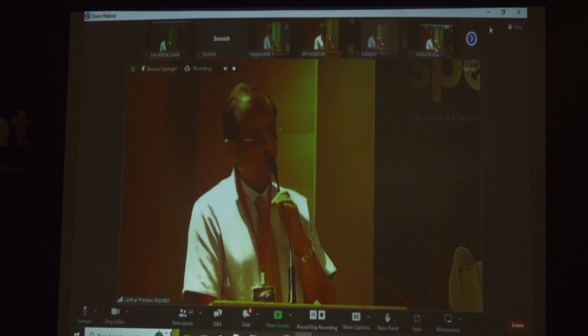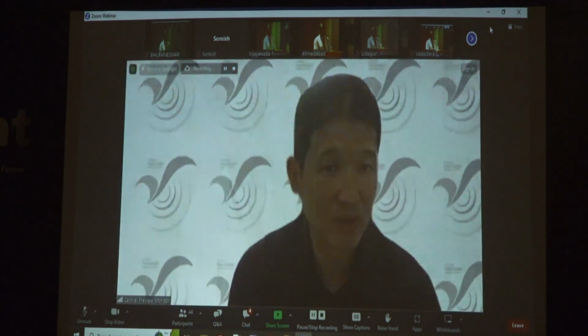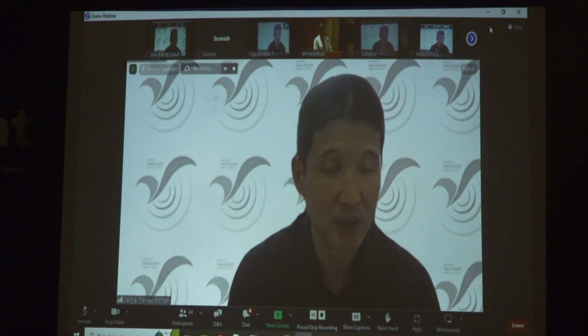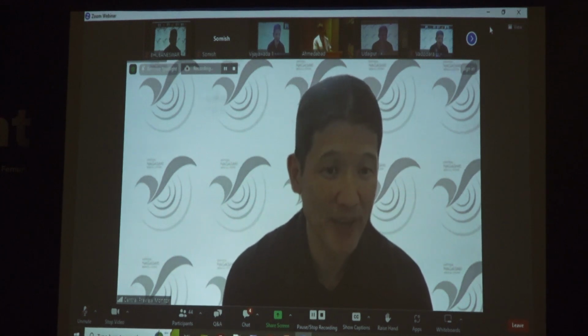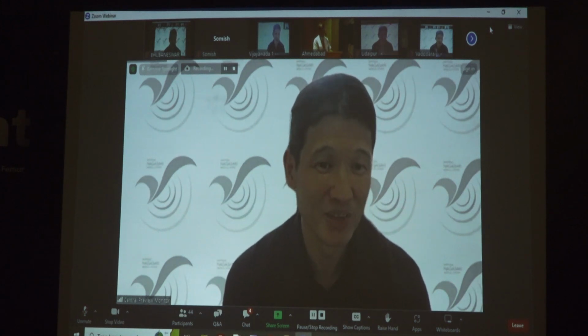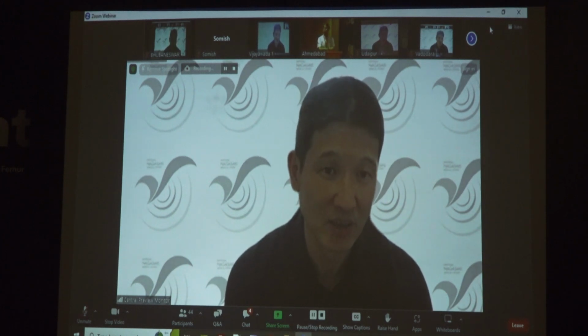What is your opinion? The problem I think we have is if you put the smaller diameter implants, the typical Japanese lady, over 80s and 90s, is very osteoporotic, and the relative stability turns into unstable fixation, which means it will be the failure of the fixation.